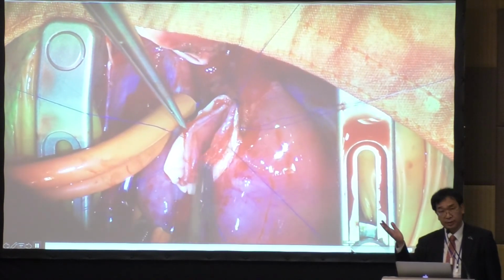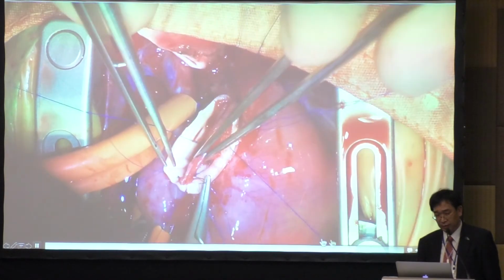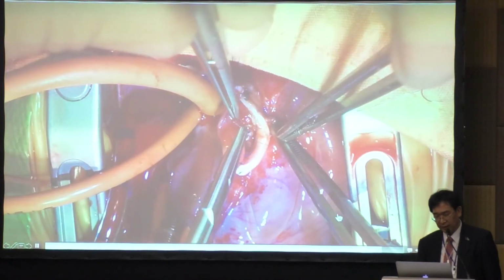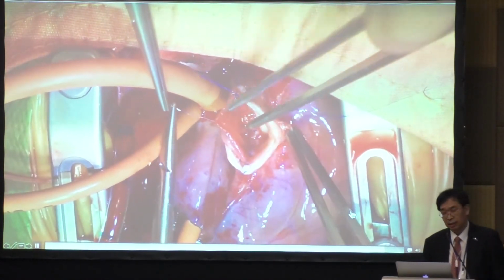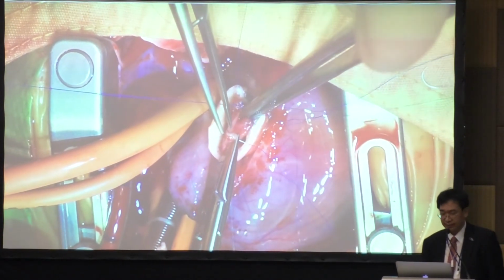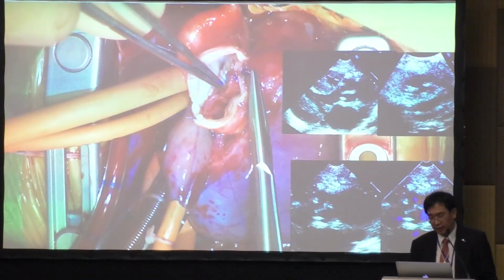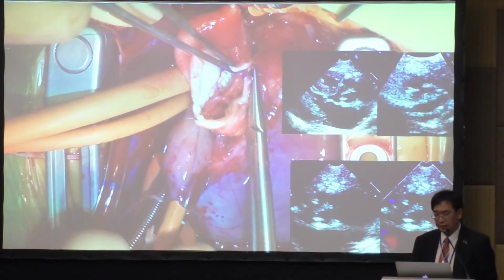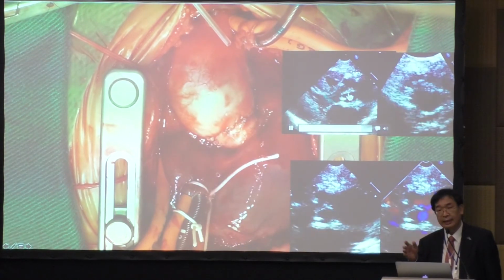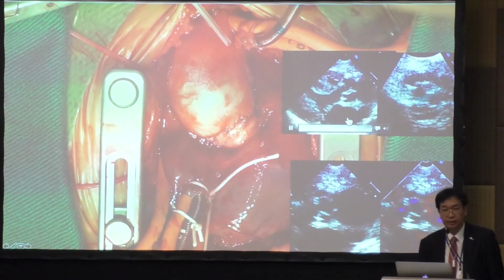Anyway, I made a little larger leaflet. So I did a plication of the peripheral part, and finally a central plication to make not a natural, but an Arantius body. This patient had a very good result, with a large opening, but a little bit longer leaflet than I expected, but no stenosis, no regurgitation.